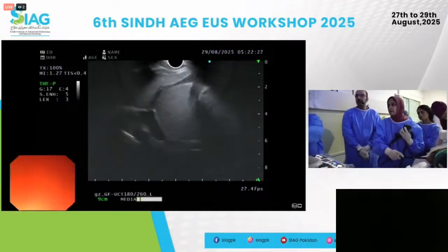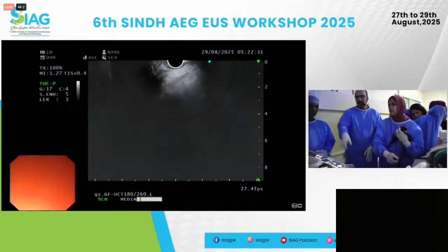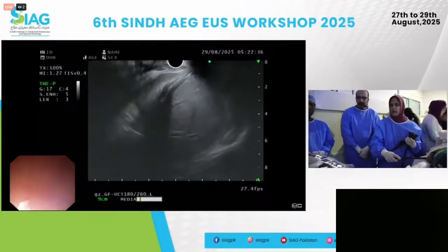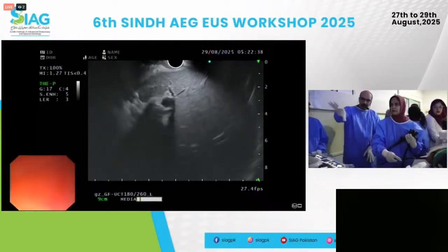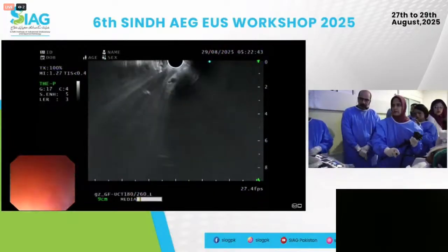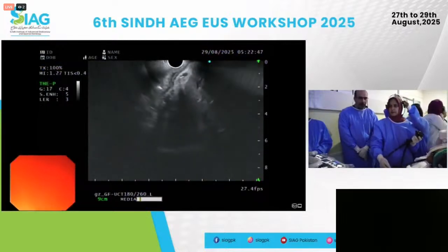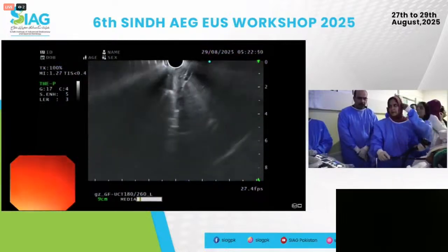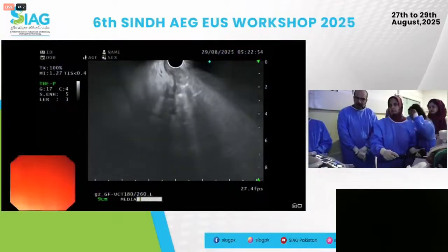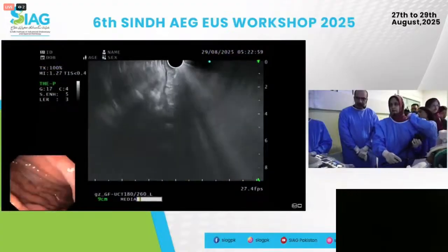So we're just at the GE junction, and so look endoscopically, make sure you know where you are. Find your lumen endoscopically, okay? So go ahead and drop your left hand. So go counterclockwise. Keep going counterclockwise. There you go. Now advance a tiny bit. It's okay. There, stop. Okay.